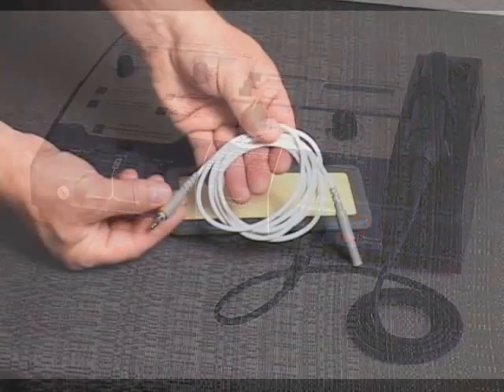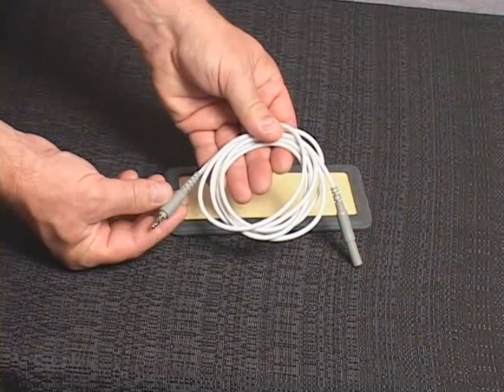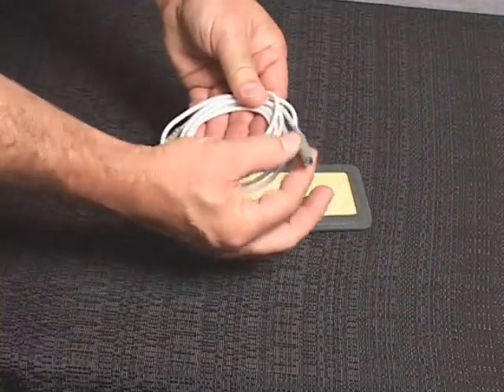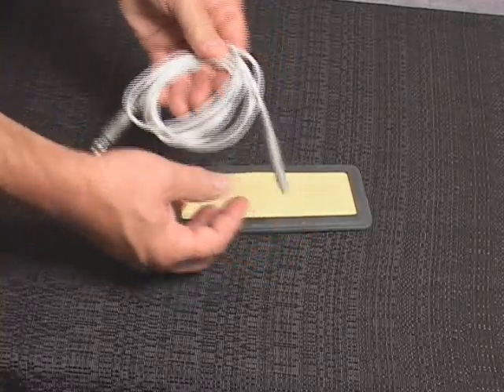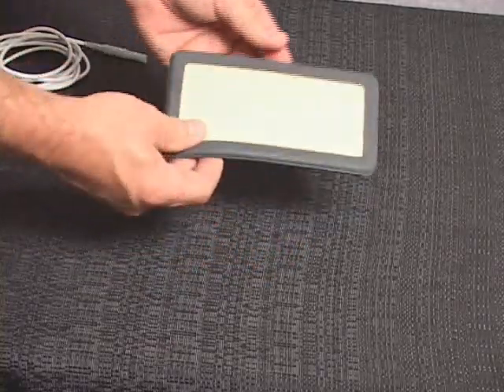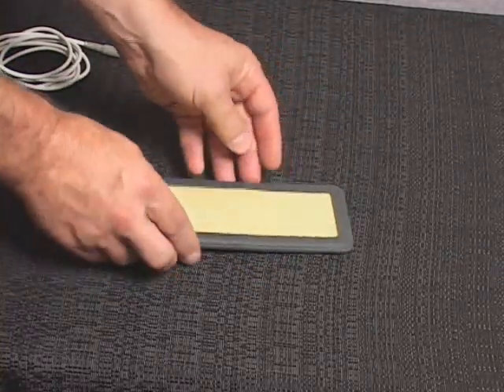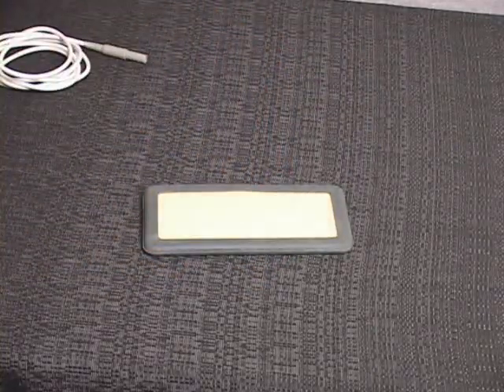The patient leads should always be checked for proper connection and damage or deterioration prior to treatment. Loose connections or damaged cables can cause low stimulation output, no stimulation output, or sudden irregular increases in output, resulting in possible discomfort to the patient.